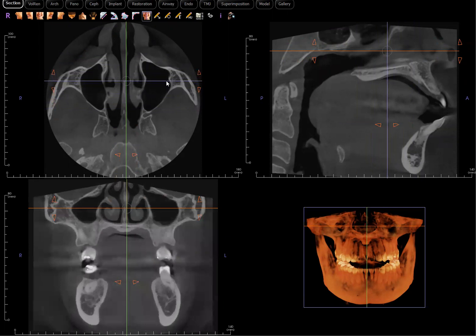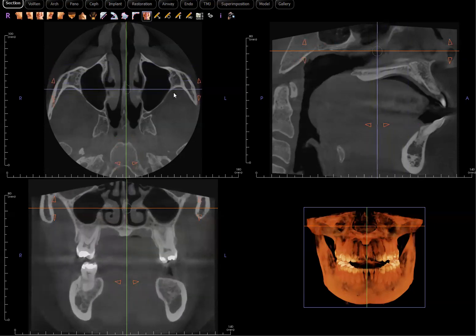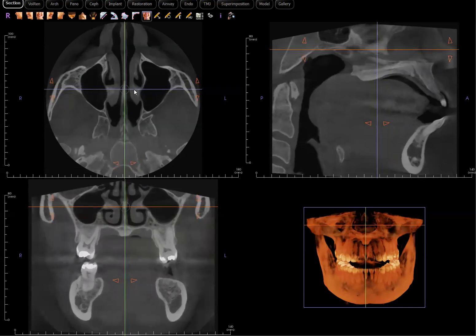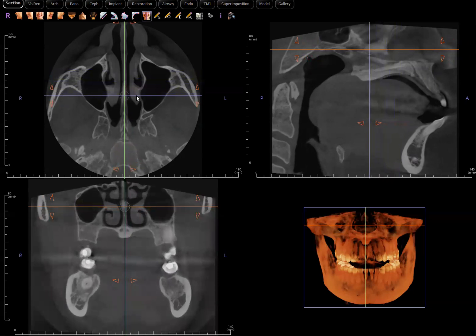In today's video, I wanted to talk about an anatomic variation that I've run into maybe once a month or so. We look at about 60 to 100 scans a month, and so the prevalence from my clinical experience is perhaps about 1% or a little less than 1%. And that is hypoplastic maxillary sinus.